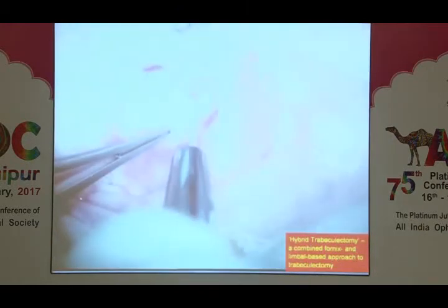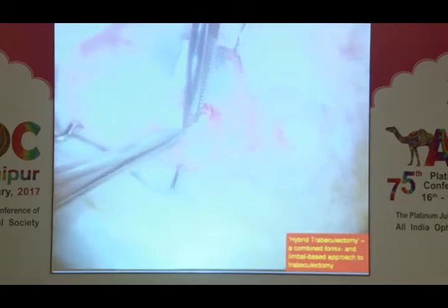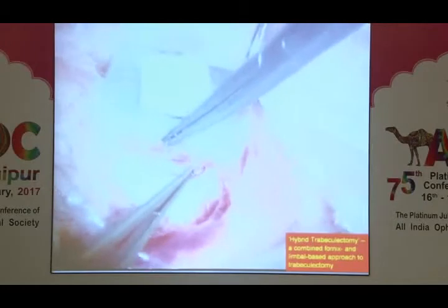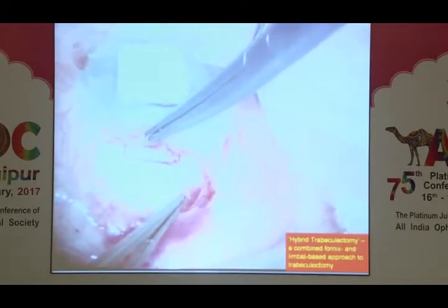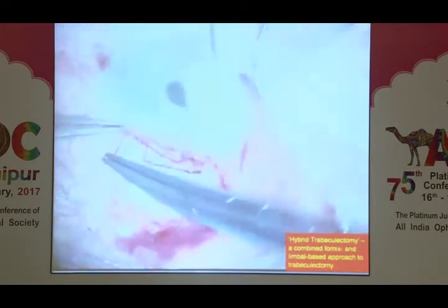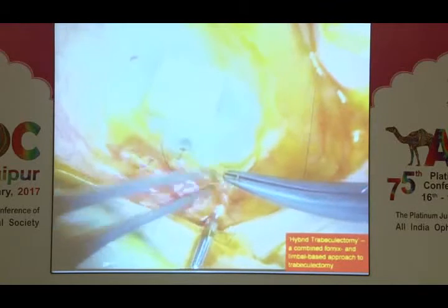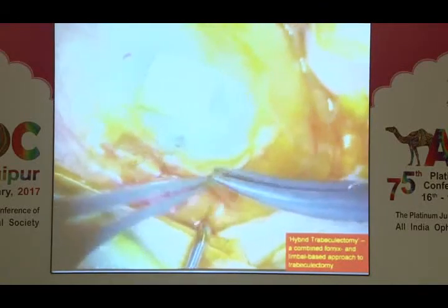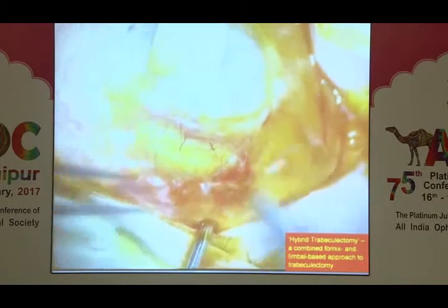And we prepare the flap as you all do, and I won't need to elaborate on how to prepare the flap, just to suffice it to say that I don't extend the vertical wounds on the side right up to the limbus, so as to prevent any leaks in those areas. Now, obviously, we have prepared the bed, the subconjunctival tissue, with the mitomycin, and once the releasables are all inserted, as you can see, there are 2 releasables and a fixed suture to the flap.